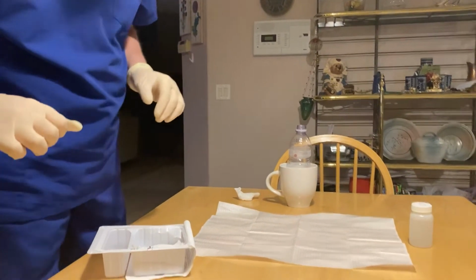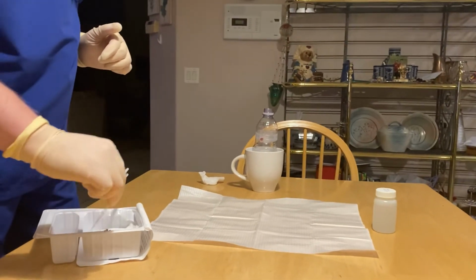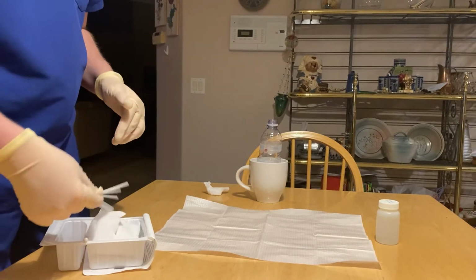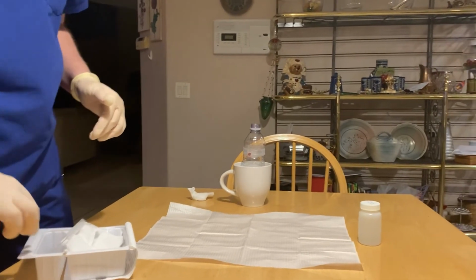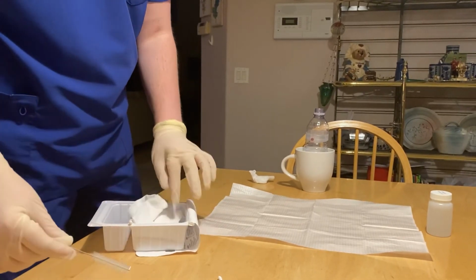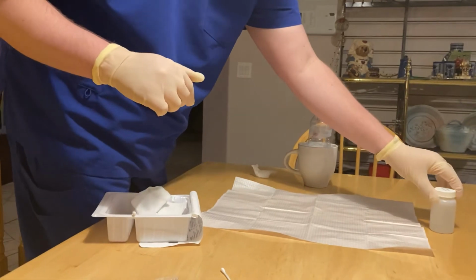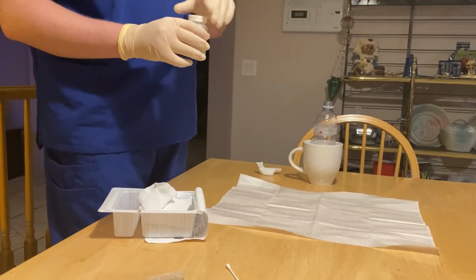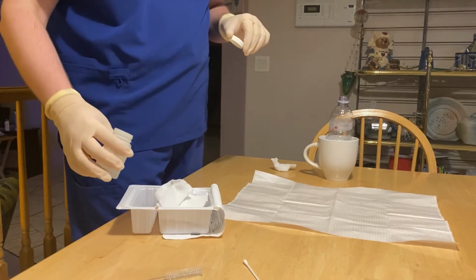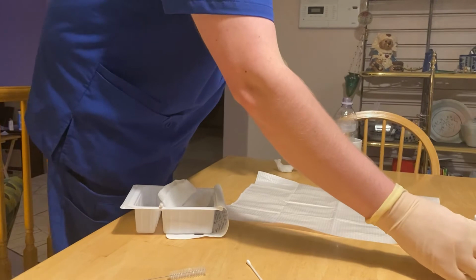And then I'm done with the sterile part of this. So my next thing would be I'm going to remove the things I do not need. So I'm going to remove these. Whoa. They do not want to be removed, I guess. So then I have sterile saline that I would pour in here. Since I'm done with sterility, pour it in. Get that out of the way.